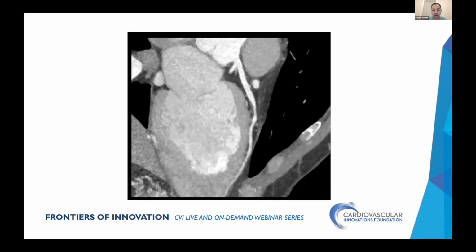True. I see it more often now, and then we're using our TAVR work, because with TAVR you need to be CT savvy to kind of rotate the heart to find the annulus, to check the LVOT. So that's very helpful skill when we look for the arteries. These pictures one of my fellows was able to extract from a raw data from CT scan, but we're now able to kind of cut through good planes and get the pictures. Manos is spot on.